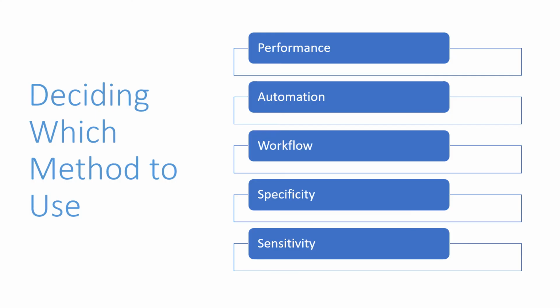There are many differences between the three tests. Some reasons why you may choose to utilize one over the other could be due to the differences in specificity and sensitivity. IIFs are able to identify ANAs more specifically through the formation of patterns on the results, while the other two methods only yield positive or negative results.